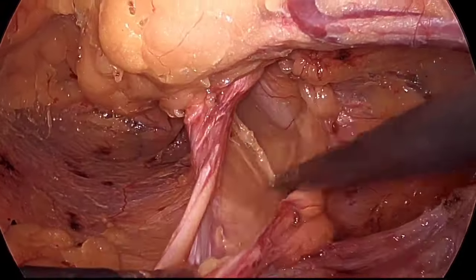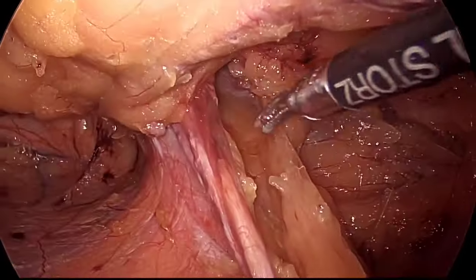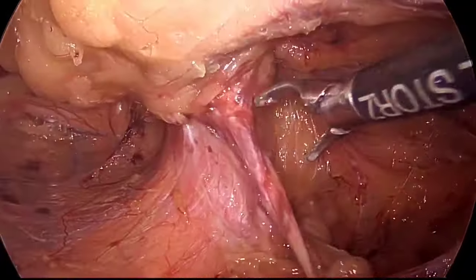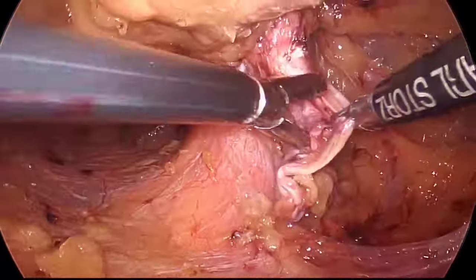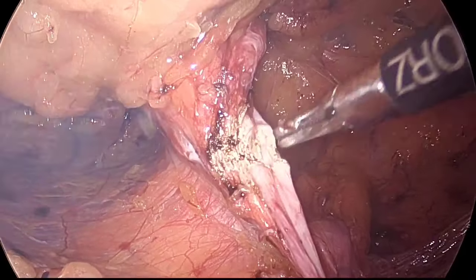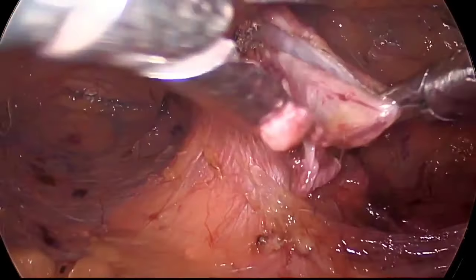So the distal sac will atrophy with time, and this is the proximal sac which I am dissecting, and then I will be incising to divide the sac at this point, at the point of the internal ring. So you can see I'm using a good amount of traction with my left hand instrument, and using Maryland forceps with monopolar energy, I have started dividing the sac. It was a big defect, so the hernial sac margin was also big.